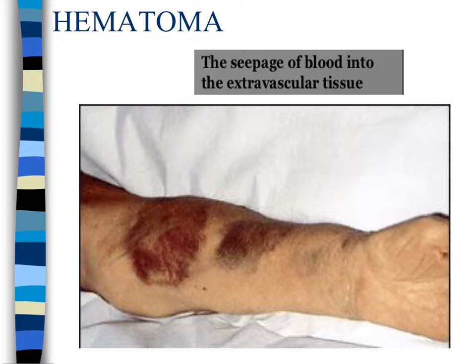Prevention includes using indirect methods of venipuncture, applying a tourniquet just before venipuncture. For the elderly, patients on corticosteroids, or patients with paper-thin skin, use a small needle or catheter, preferably a 20 or a 22 gauge. Use a blood pressure cuff rather than a tourniquet so you have better control over the pressure. Be gentle when performing venipuncture. In documentation, we are going to observe any ecchymotic areas and document any nursing interventions used to care for those sites.